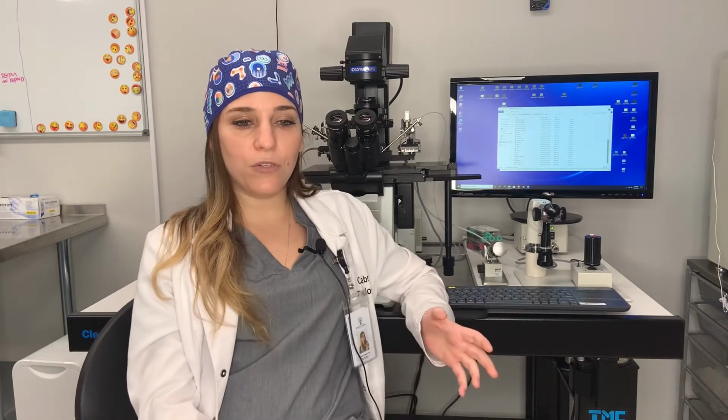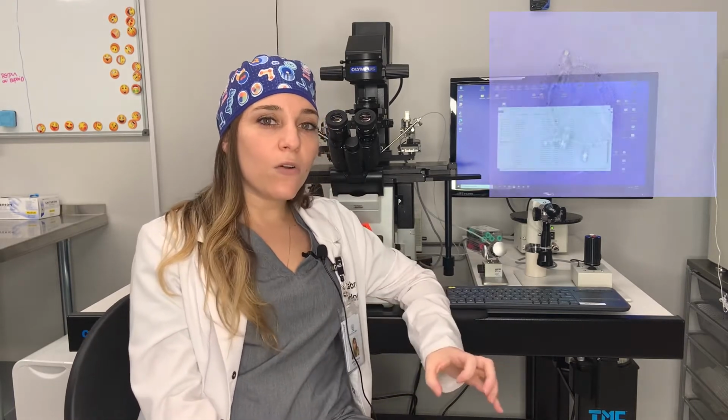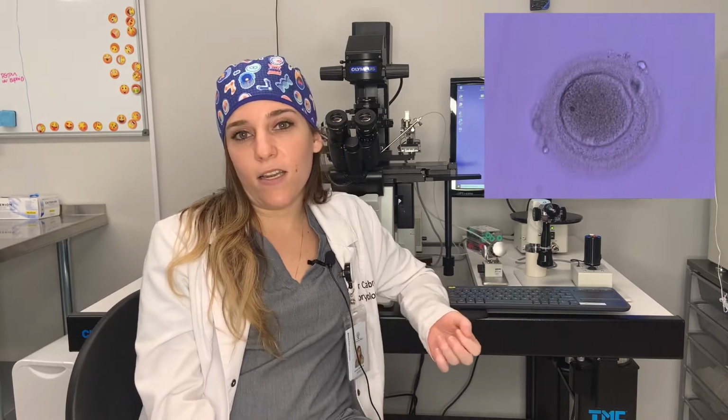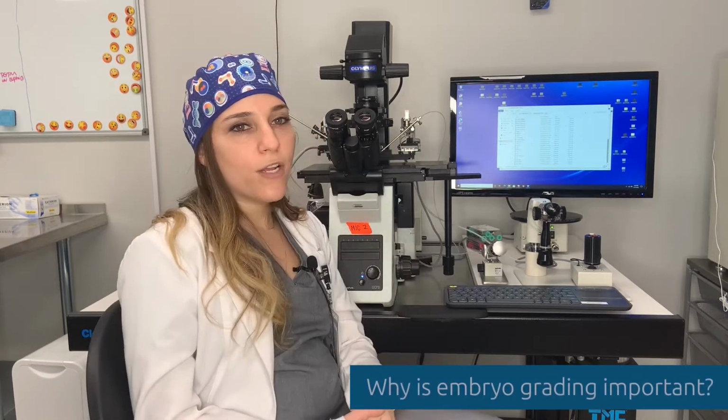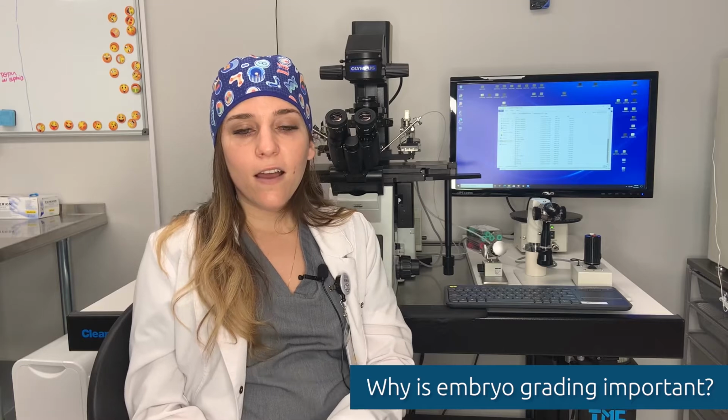There are other ways that we classify oocytes that don't refer to maturity, but refer more to embryo quality, which is sometimes referred to as an EZ, an empty zona, which is essentially a shell of an oocyte without an actual egg inside of it. We could also make a note of something being called atretic, which another word for that is arrested or isn't viable.